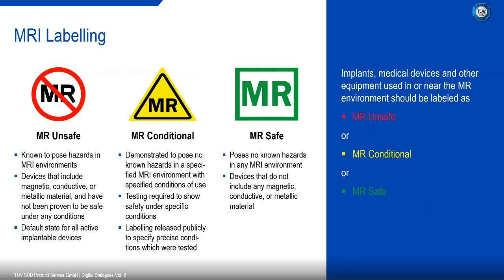MR unsafe labeled devices are known to pose hazards in MRI environments and are applicable to devices that include magnetic, conductive, or metallic material and have not been proven to be safe under any conditions. This is the default state for all active implantable devices.